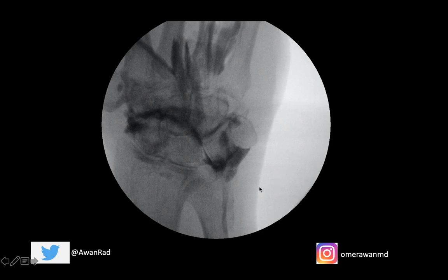The way we do that is we use a dorsal approach and we put our needle right here onto the scaphoid bone. This is one of the carpal bones in the wrist. This is the scaphoid bone right here.